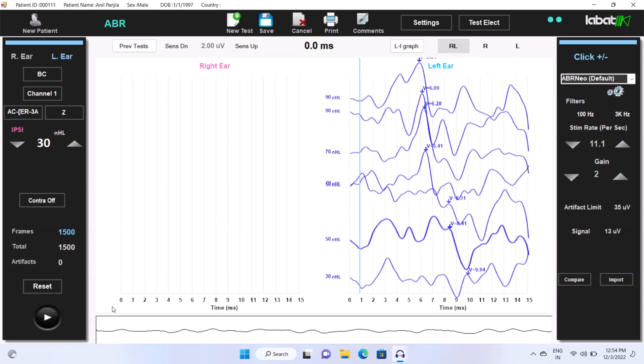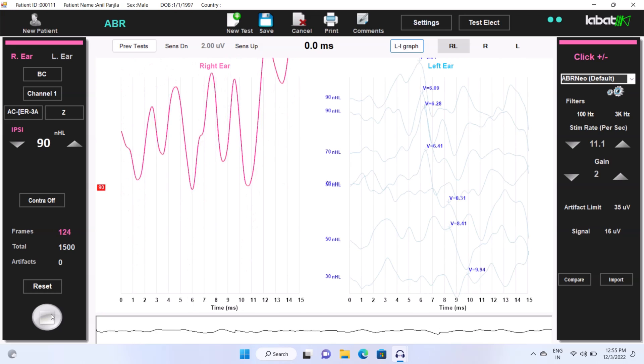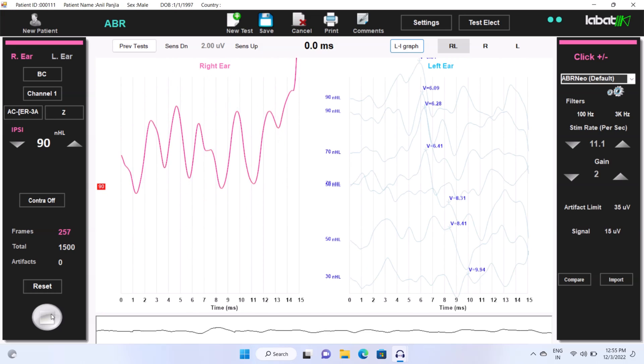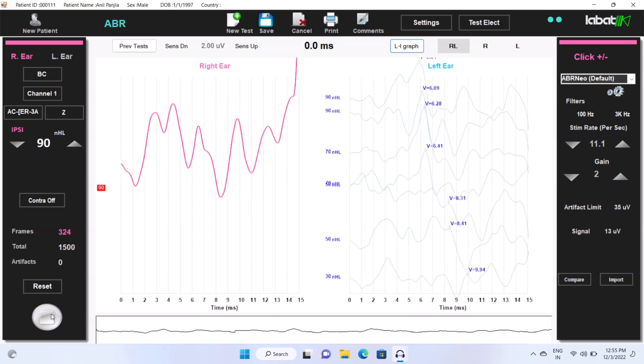Now we get the perfect result. Now select the other ear and select same intensity.